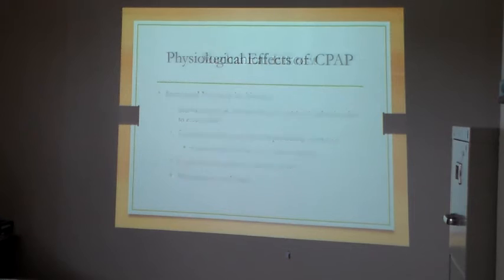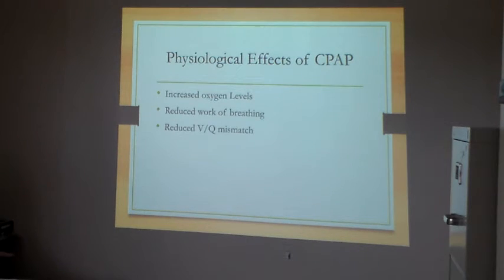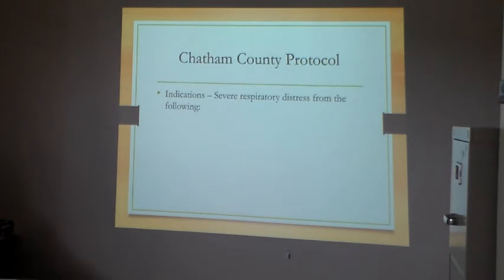So what I'm going to show y'all now is about the physiological effects of CPAP. And it reduces your work of breathing. We've said all these things before. Our protocol is, like I said here in Chatham County, that we put it on anybody that is in pulmonary edema, either from drowning or from CHF. We put it on asthma patients.